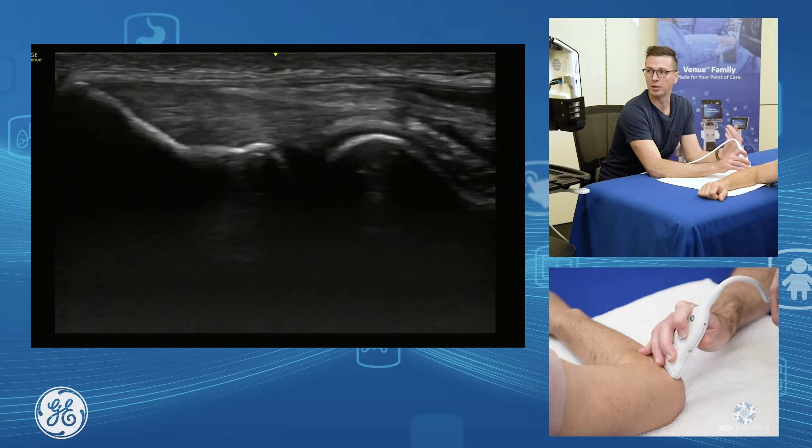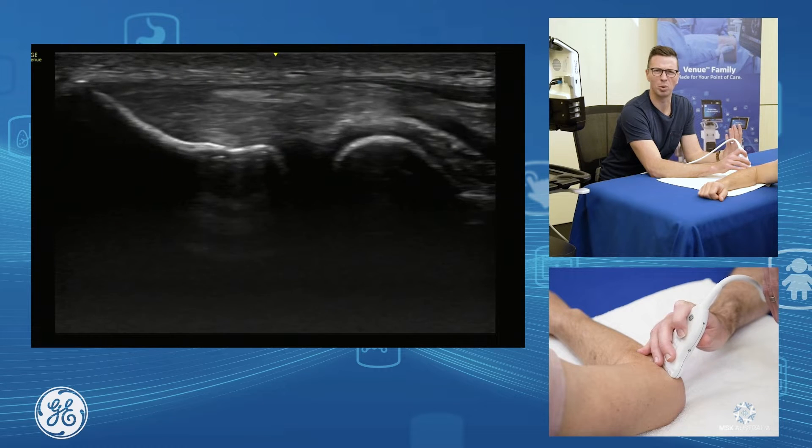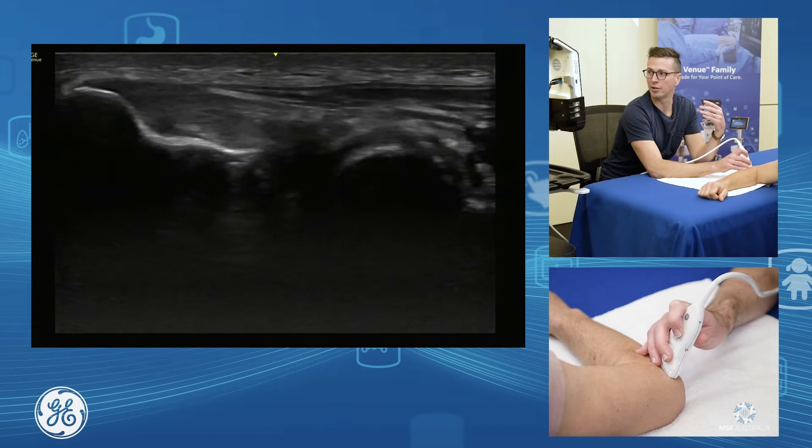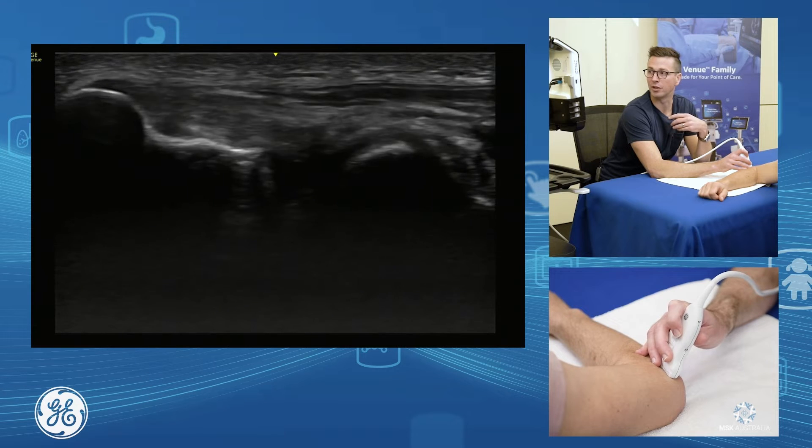If I bring my probe a little bit sitting straight in the middle of the common extensor, covering most of the bulk, and as I bring my probe up towards the patient's head, I get more up into the extensor carpi radialis brevis component — the main component of your common extensor.